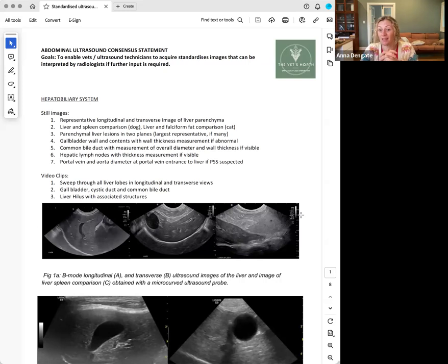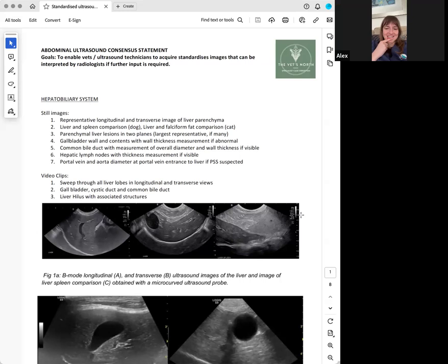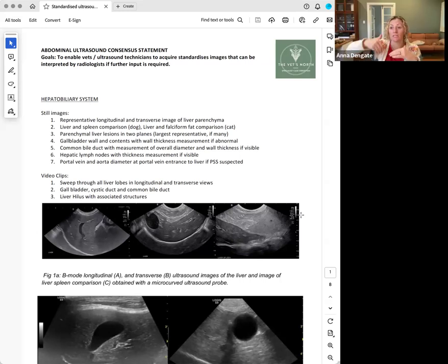And then the other thing is it's not a really rigid structure as opposed to the aorta. And sometimes to get that view, you're pushing really hard. Have you guys ever squashed the cava when you're looking for a right adrenal? Yeah. All the time. So if you can get it intercostal and take that artifact out of it, that's probably better because you can't squash it if the ribs are stopping you. But whilst there are reference ranges, they're definitely guidelines, not rigid.